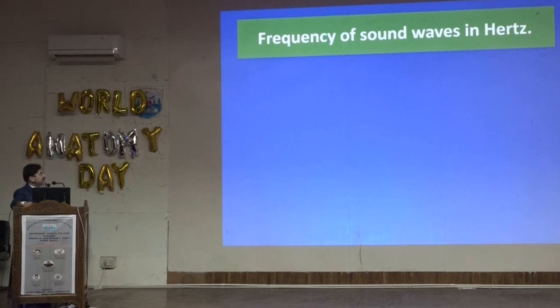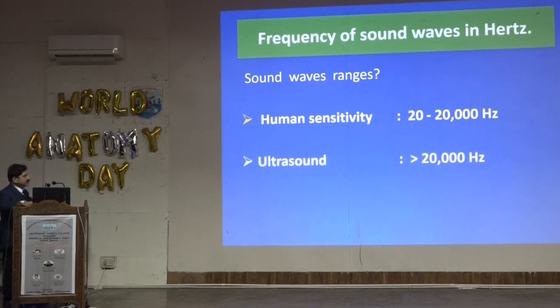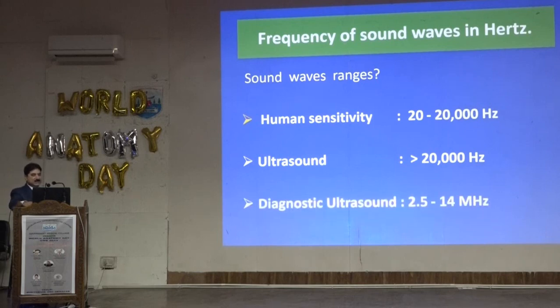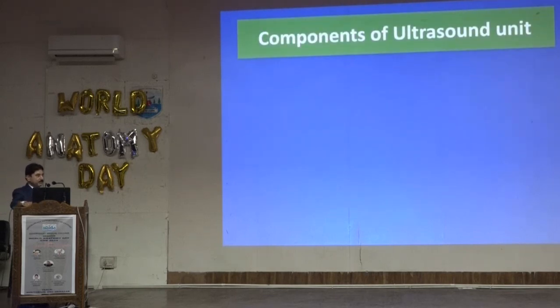The frequency of ultrasound waves or sound waves, human sensitivity is 20 to 20,000 Hz. The waves with frequency more than that are called ultrasound waves. In diagnostic ultrasound, the waves which are used range from 2.5 to 14 megahertz in frequency. The components of an ultrasound.